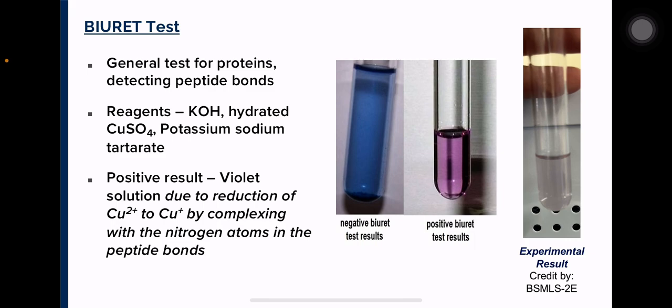Testing for urinary protein is one of the most important and valuable parts of the routine urinalysis. Albumin is one of the important proteins which appears in the urine during a pathological condition. It often occurs as a symptom of renal disease, while globulins are excreted less frequently. Bence-Jones protein is a specific type of globulin excreted in patients having multiple myeloma.